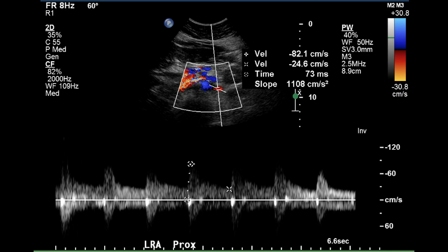The proximal portion of the left renal artery has a sharp upstroke, a very low acceleration time under 100 milliseconds, and the peak systolic velocity is 82 centimeters per second, which is less than the aortic velocity during systole at the same location.